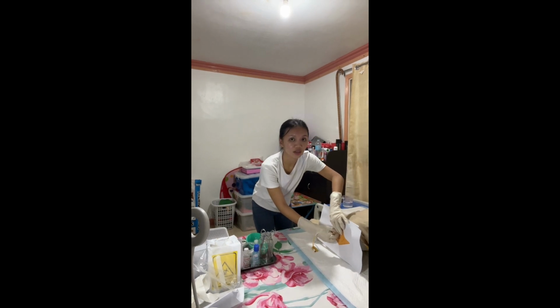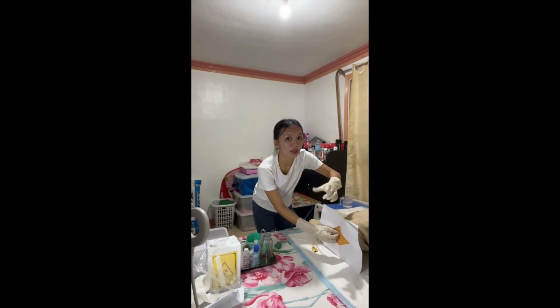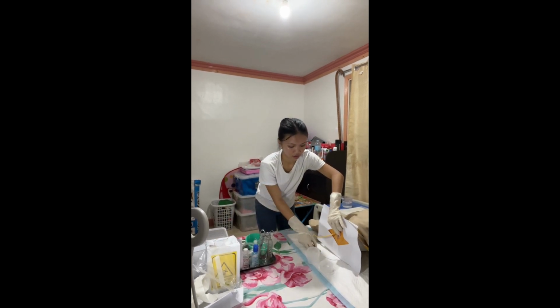Alright, so next, if a specimen is to be collected, we are going to pinch the catheter with the thumb and finger while placing the specimen container in position. So we are going to get our specimen container and then place the catheter in it so that we can get a specimen.